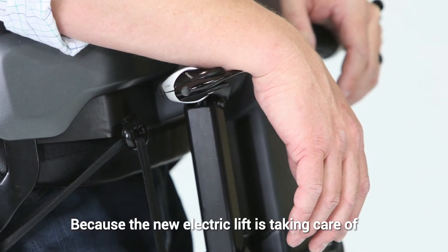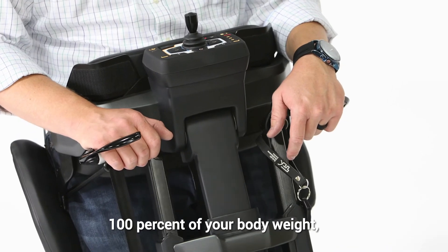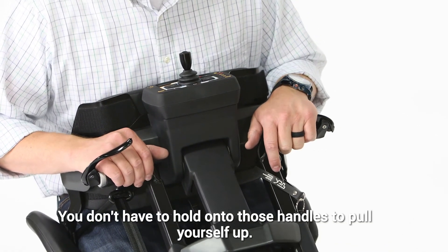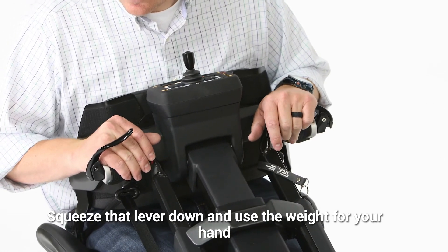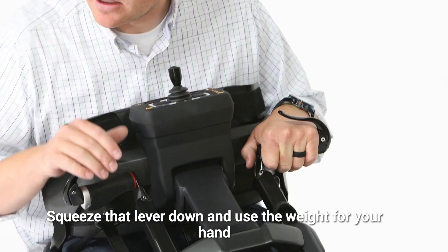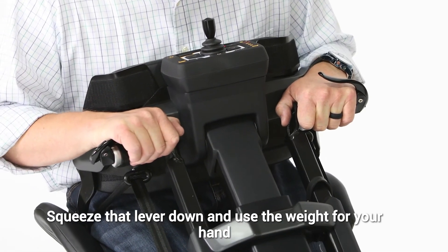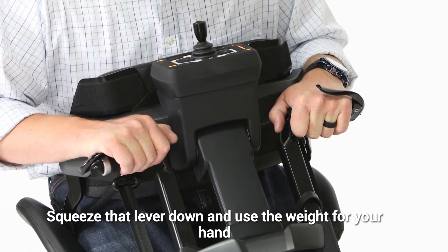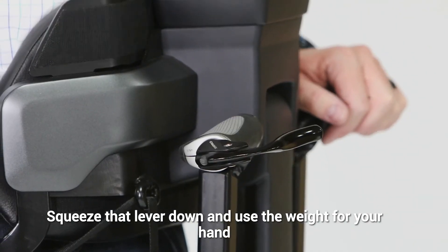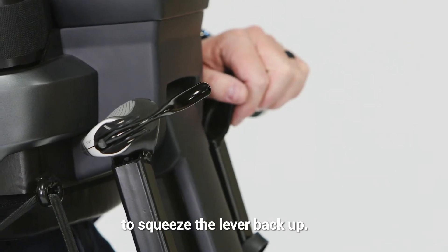Because the new electric lift is taking care of 100% of your body weight, you don't have to hold onto those handles to pull yourself up. You essentially just use the weight of your hand or your arm to squeeze that lever down, and use the weight of your hand to squeeze the lever back up.